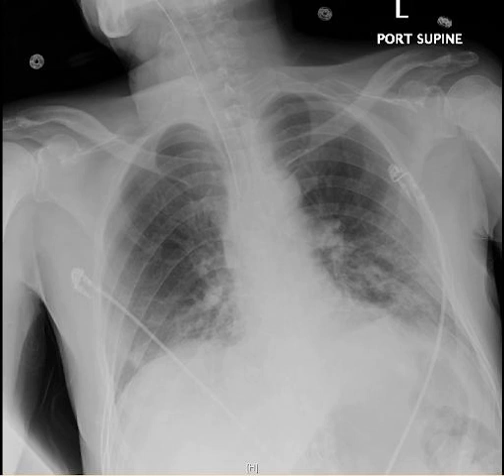As patients get more confluent ground glass opacities, you'll often get what's called a coalescent B line or a waterfall sign, where you see a lot more of a B line. And then finally, when you get really dense consolidation from really severe COVID, sometimes you'll see what's called hepatization of the lung, where the lung actually looks like liver when you ultrasound it. Ultrasound has some advantages in which you can do it just while you're doing your normal physical exam. But again, all the findings are not specific to COVID. These are things that you can see in a lot of different disease processes.